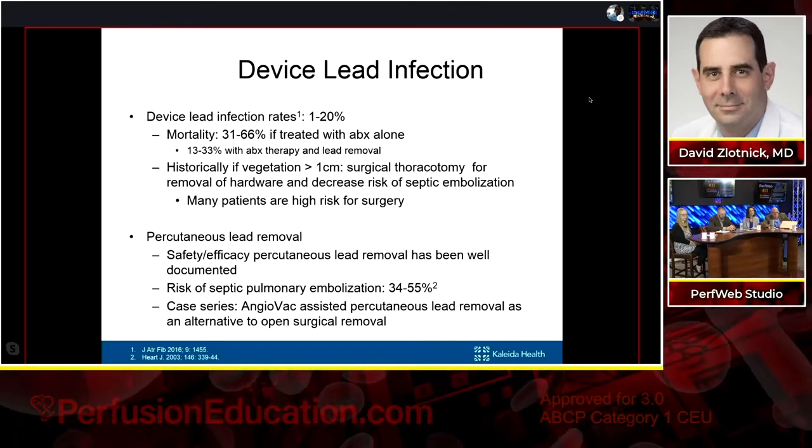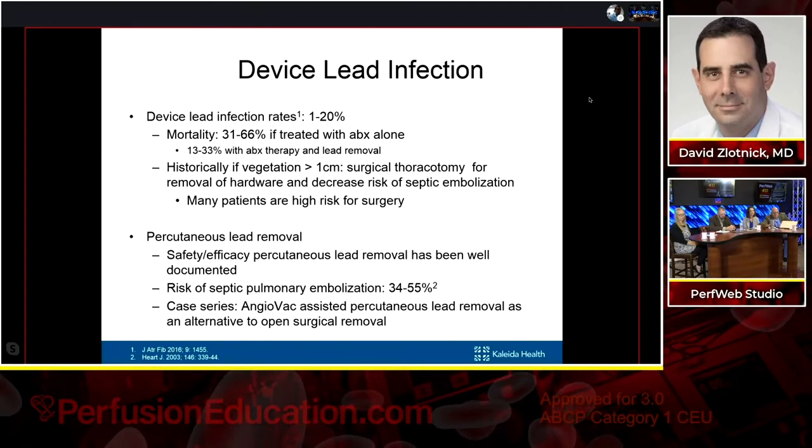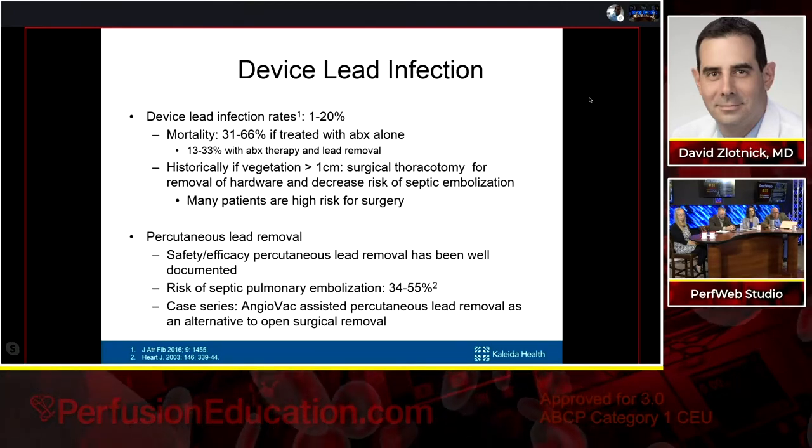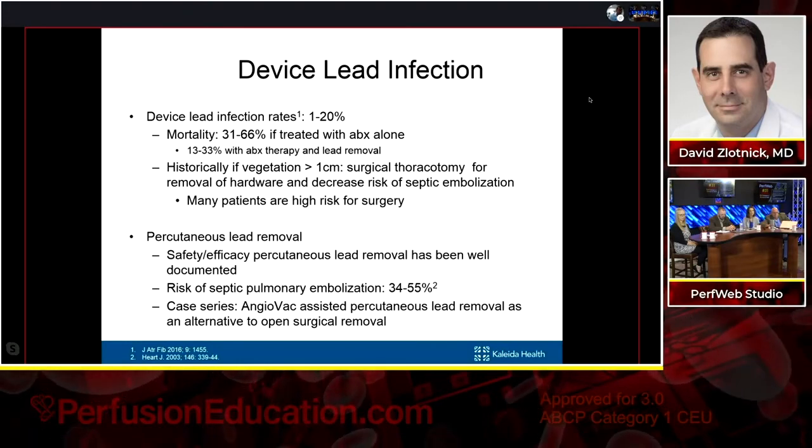However, in patients who have large vegetations, the risk of septic pulmonary embolization is anywhere from 34 to 55%. And this is really where AngioVac-assisted lead removal may play a role.